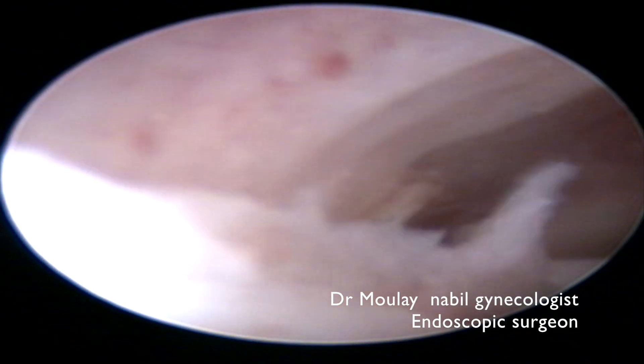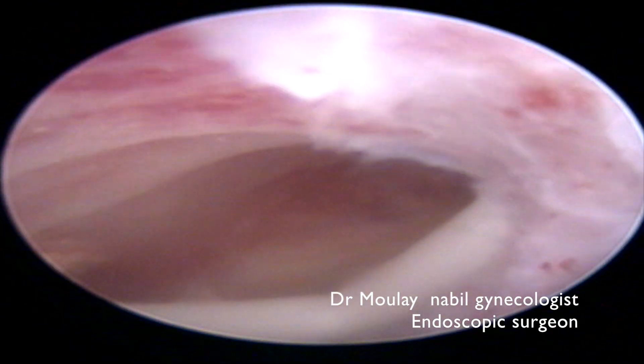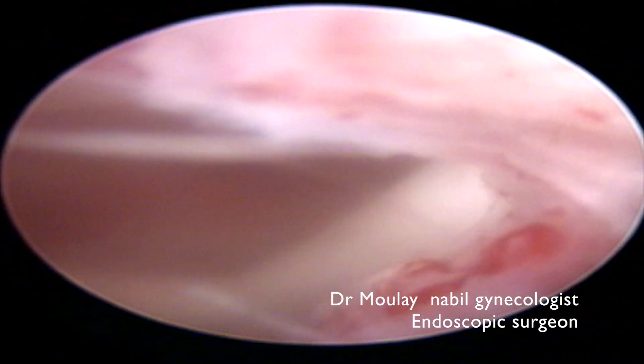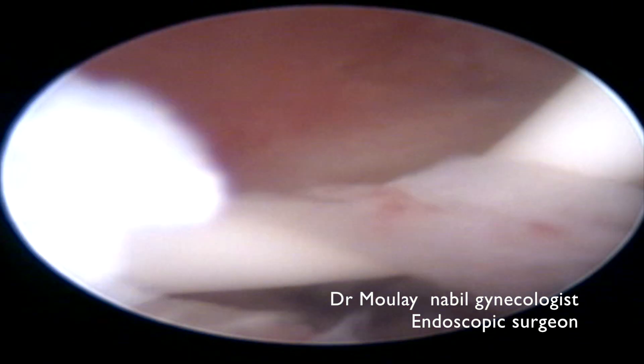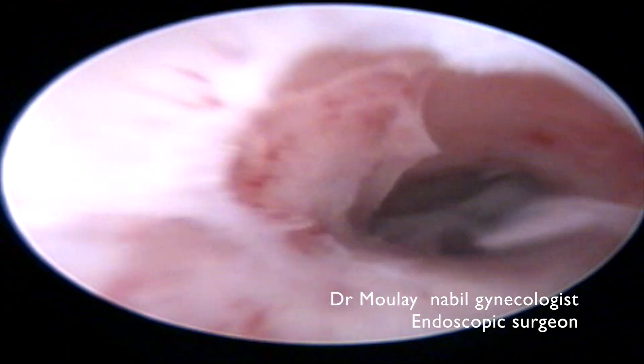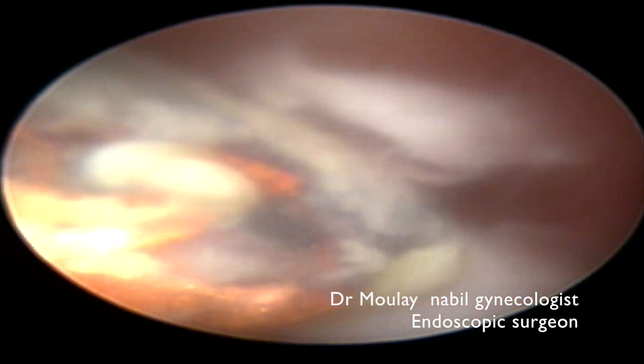In this case, we use an operative 5mm sheath with a hysteroscopic grasper. We remove the first sheath and proceed with the new operative sheath.